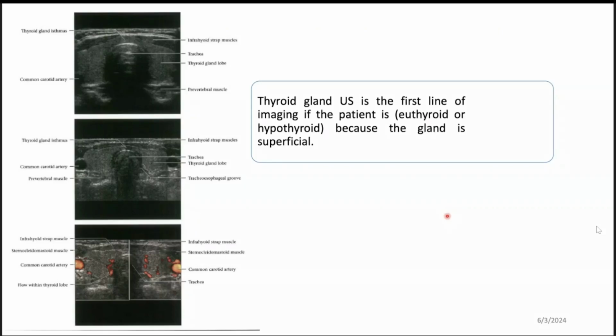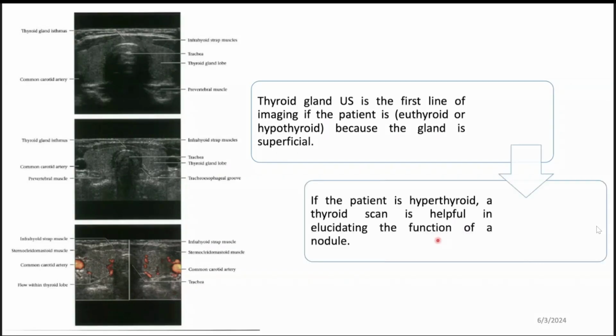So we always start with ultrasound. And if the patient is hyperthyroid, a thyroid scan, which is an example of a nuclear medicine study, can also be used.